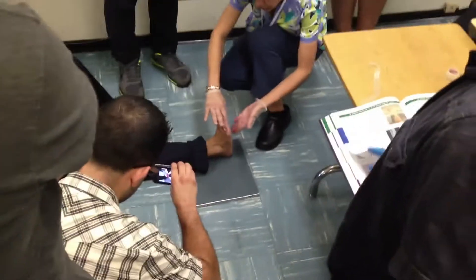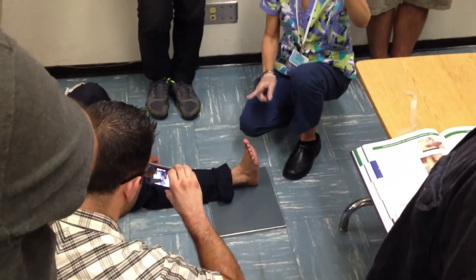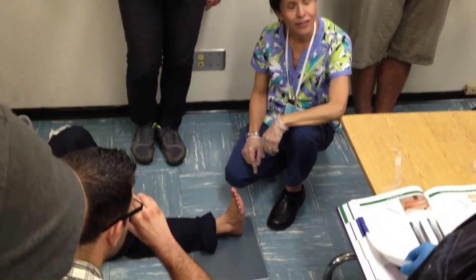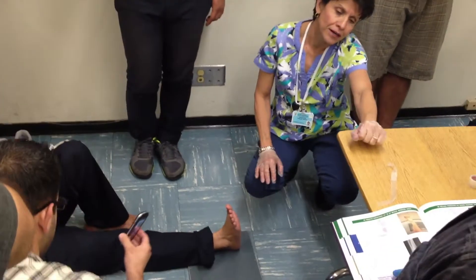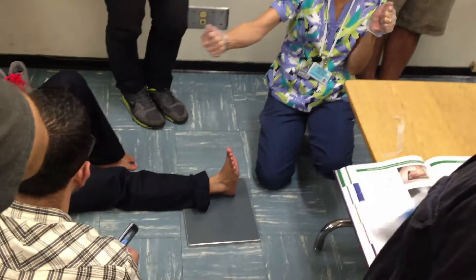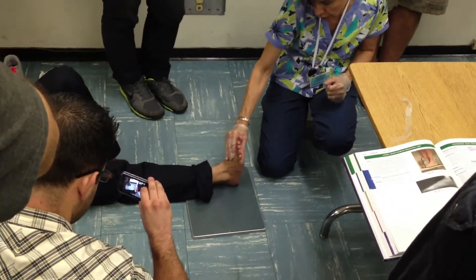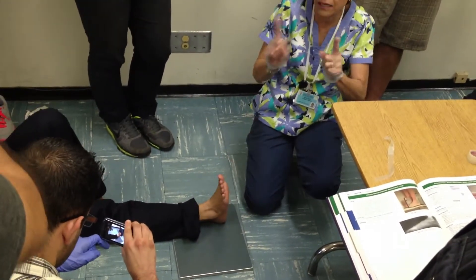This is the one with the 40 degree angle. I'm going to come in from here. You want elongation of the heel. Martin said he's going to get elongation, and that's your number one critique — you want stretching of the heel. If you don't get that stretching, you either positioned the patient incorrectly or you don't have your 40 degrees. That's your number one critique.